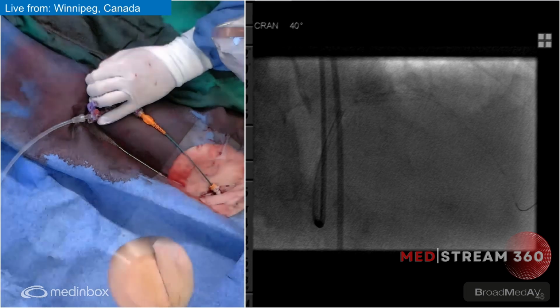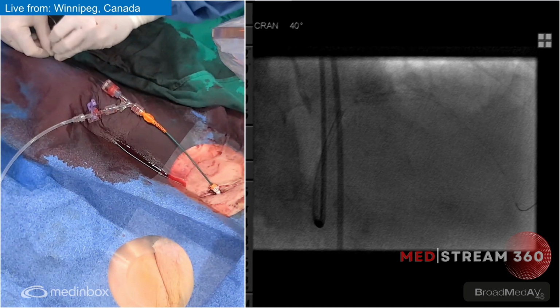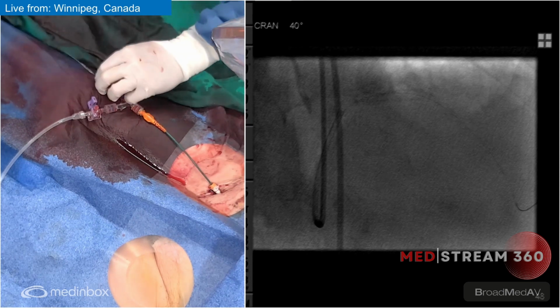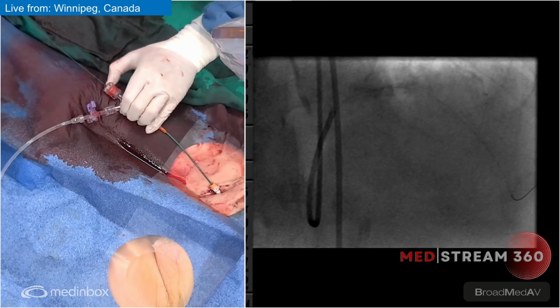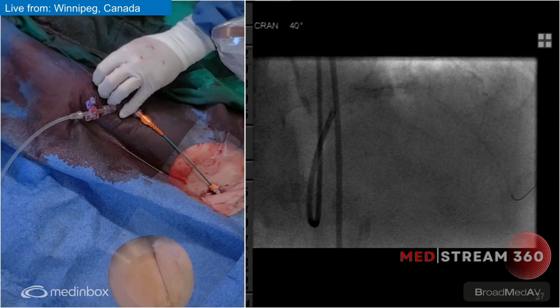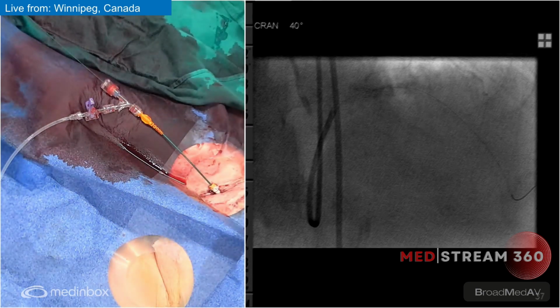The question that always comes up now is you've got a lesion there, you've got some recoil, post dilate or OCT again. Let's see. Puff there for me. Let's make sure we don't have any excitement anywhere else. That looks brilliant. I think it looks pretty good. I would say let's just do an OCT. Save contrast. Let's do an OCT, and then it takes the second guessing away from whether we have enough expansion of our stent.